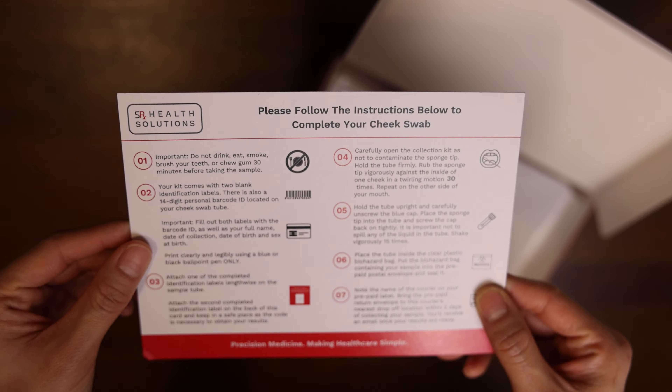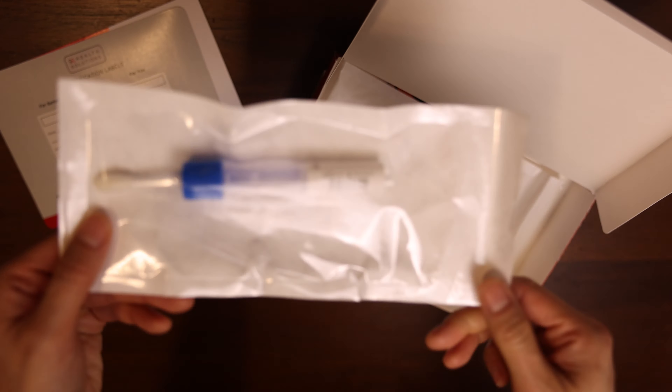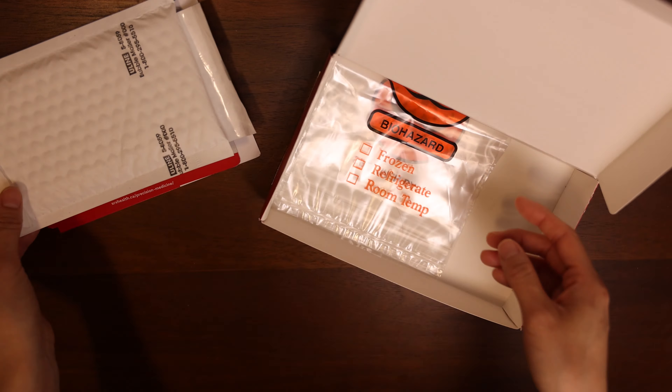Follow these instructions to complete your test. It's important to not drink, eat, smoke, brush your teeth, or chew gum 30 minutes before taking your sample.